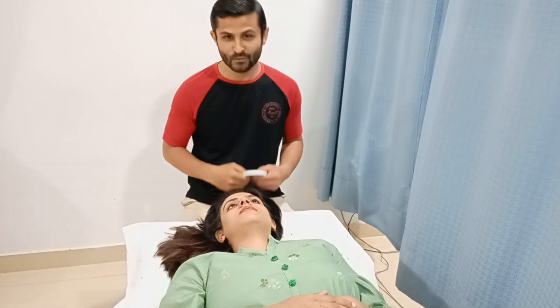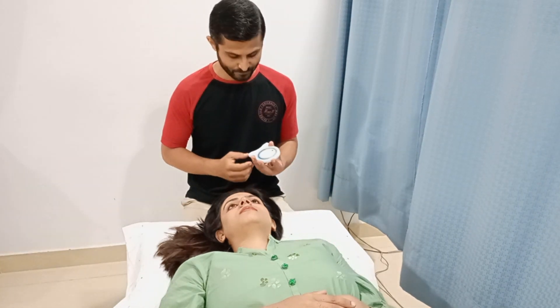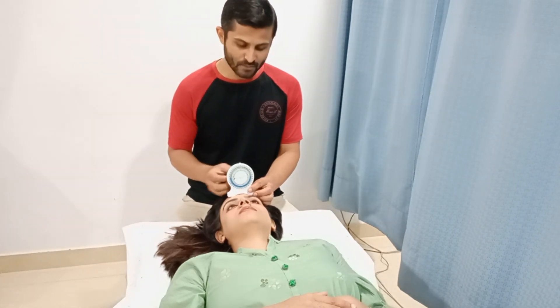In this video, I am going to demonstrate how to measure the cervical rotation using the bubble inclinometer. First of all, you need to place the inclinometer like this, and this should be facing the therapist.